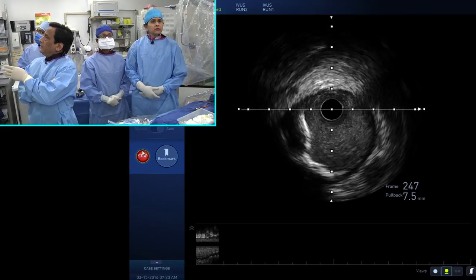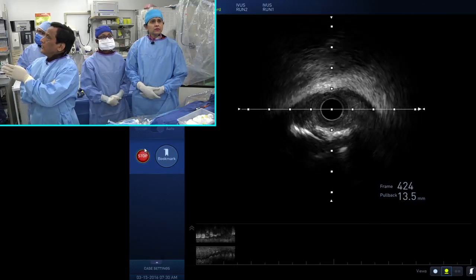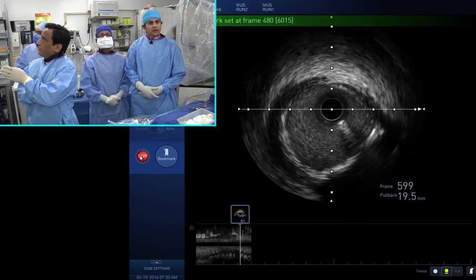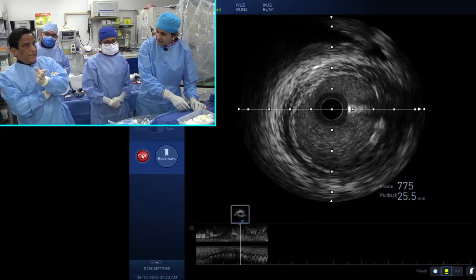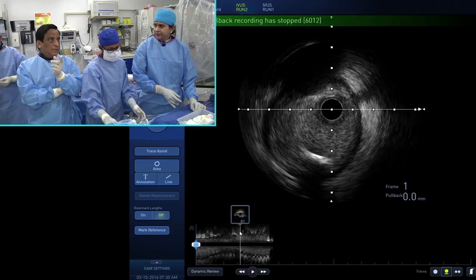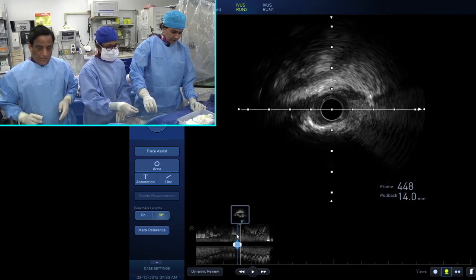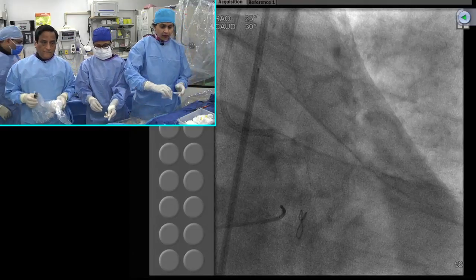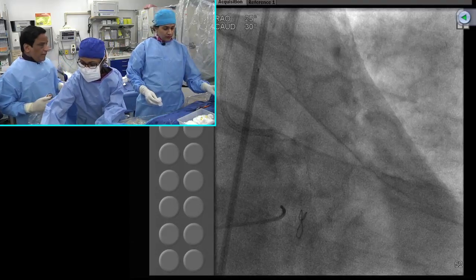Now we haven't reached 110 in the main area. Here, now coming across. There you go. Yeah, this is the one. Oof. Whole circular calcium, and then get to the left main. So a short lesion, but definitely the question is do a 1.75 burr into the LAD first, and then decide. But I think this will respond to cutting, no? The ostial, that may be okay also, and then we do a bigger burr from the left main to the LAD for adequate stent expansion after the 1.75. But you definitely want to do rotational because you are convinced about the extent of the calcification, both angiographically and now confirmed on the IVUS.